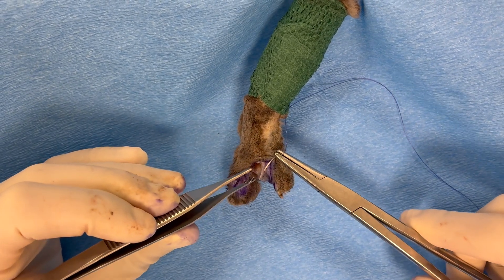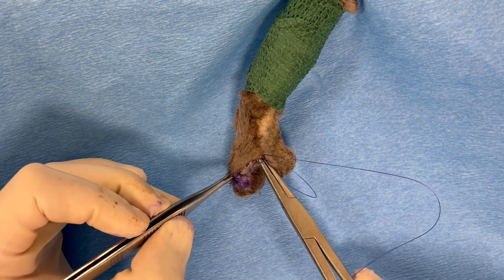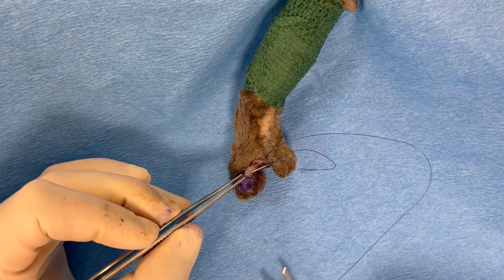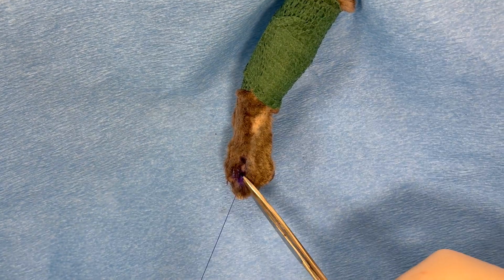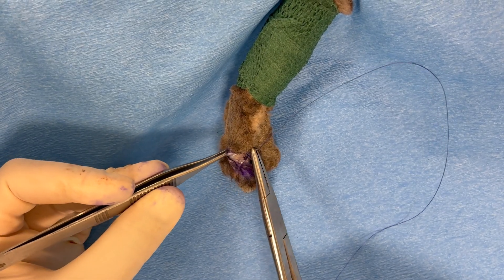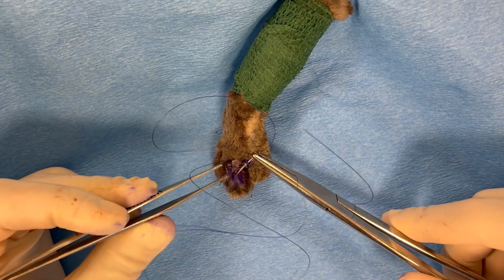Here we're going to suture dorsal to dorsal and palmar to palmar, but first we're going to apply some interrupted sutures in the subcutaneous tissues to bring those digits a little bit closer together and close some dead space. There was one suture, and now we're going to apply a second subcutaneous suture in a cruciate-type manner right here.